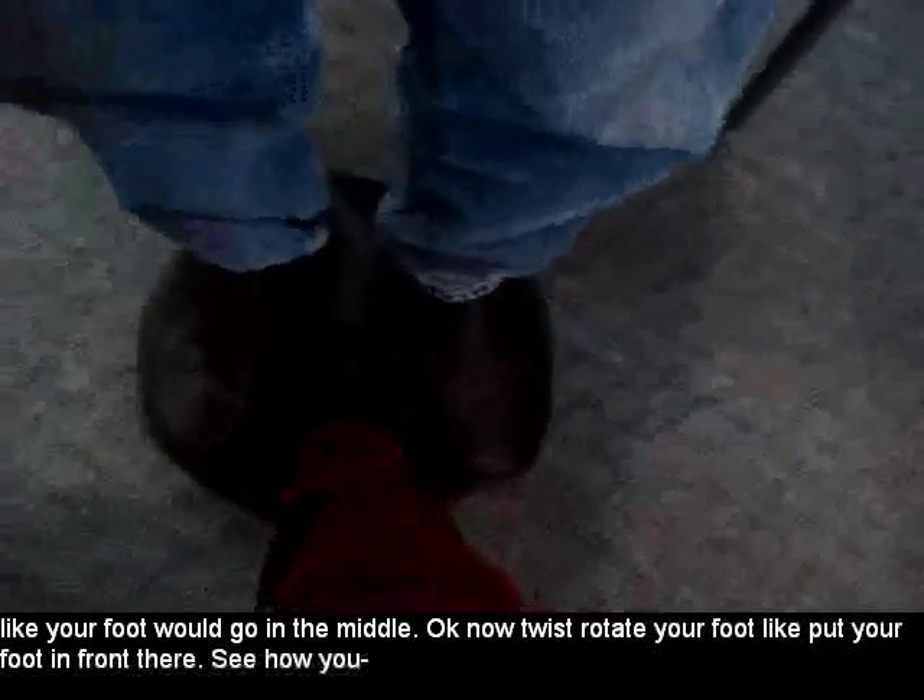Okay, stay there. Now twist — rotate your foot, put your foot in further. See how you can... Oh, look at that, I can do it with my foot! You twist me with your foot. Oh my gosh. And I'm not even grabbing you, I'm just twisting it. Yeah, wow, cool.